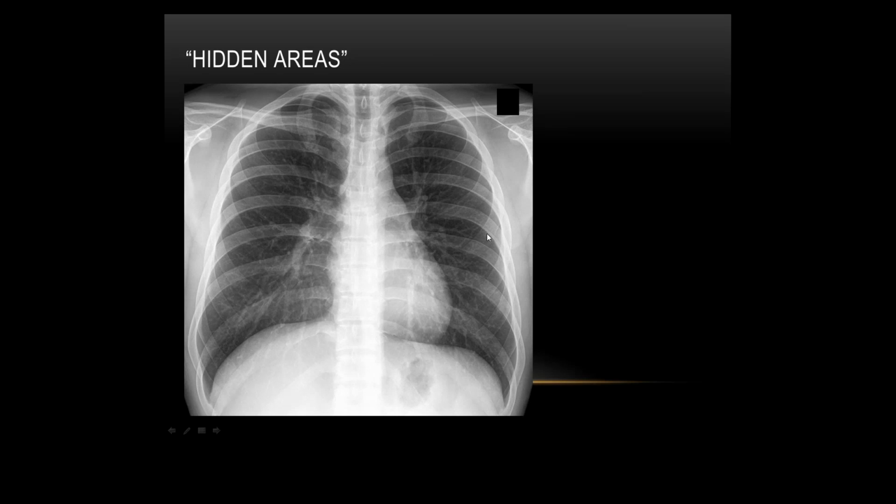Can I ask, as medical students, we also have to present it. Okay. So, present the chest X-ray, which is why I think the ABCD you traditionally use. When you interpret that, how would you go about presenting it? The ABCs or? No, well, how do you do it personally?